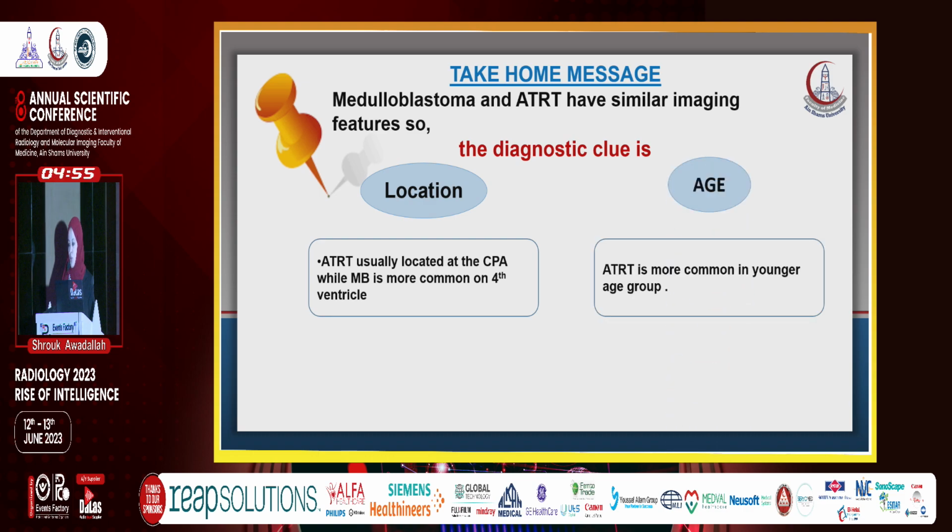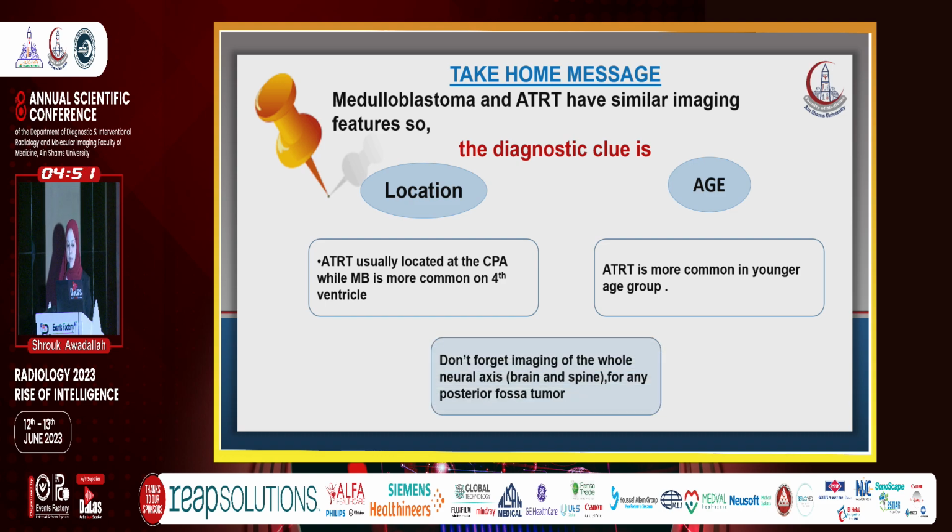In younger age group, ATRT is more common. And please don't forget to image the whole neural axis for any posterior fossa tumor to look for drop metastasis.